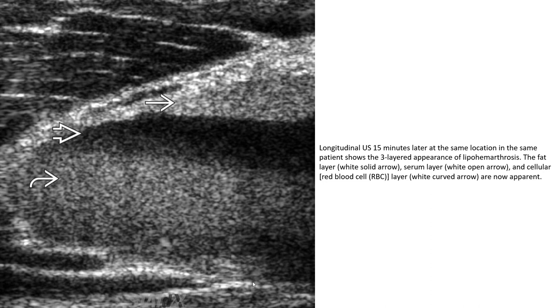This ultrasound image shows the three-layer appearance of lipohemarthrosis: the fat layer, the serum layer, and the cellular layer, all now apparent.